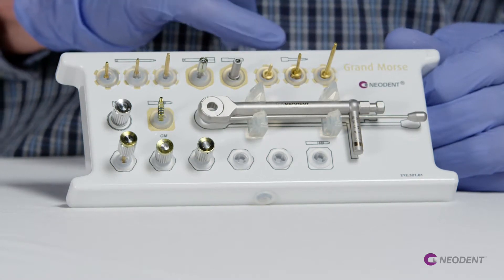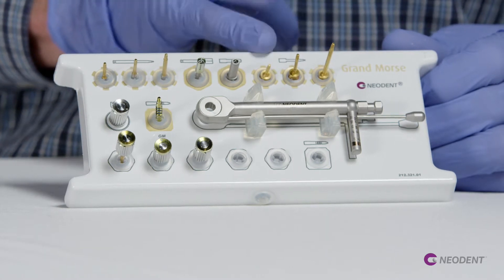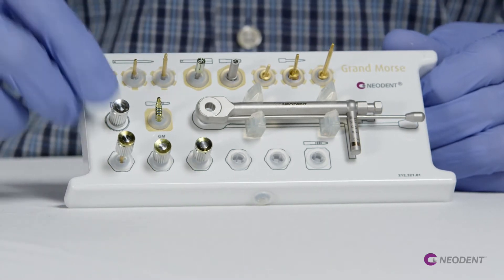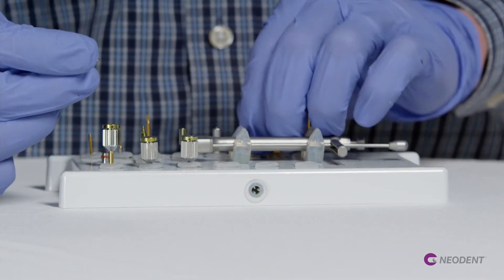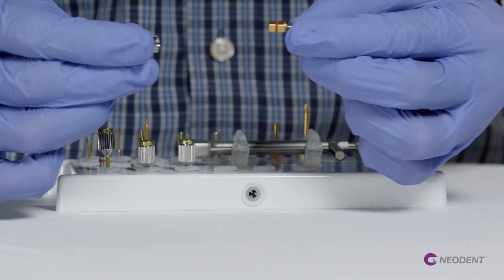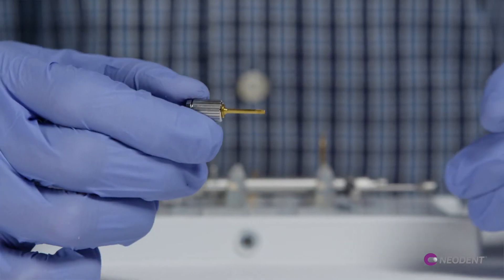For any reason, if anyone wants to use the torque drivers by hand, we have a driver here where we can put in the torque wrench driver and go by finger.